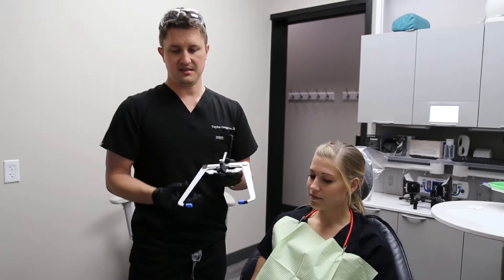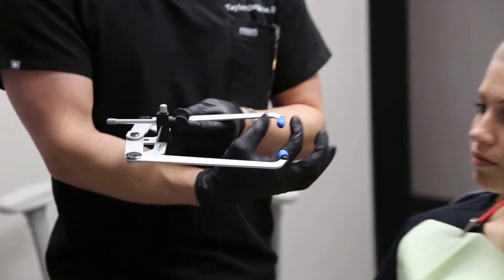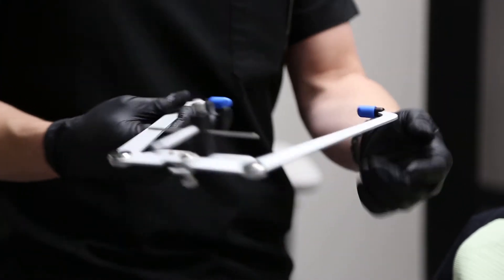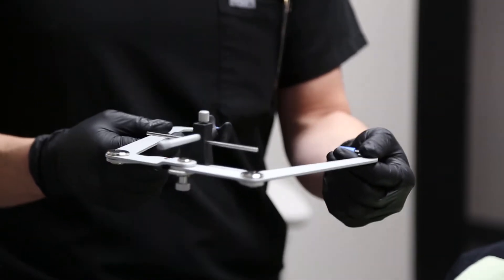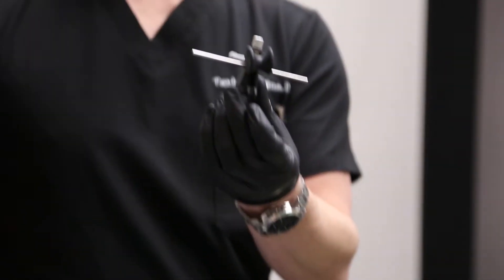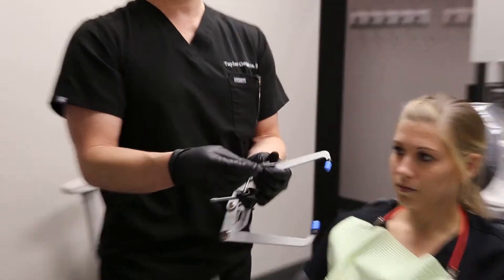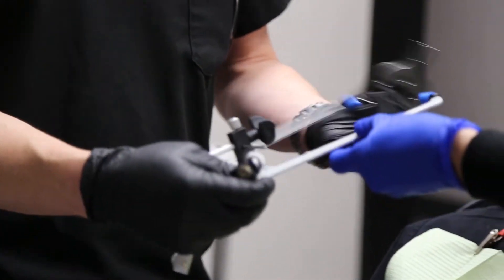This is the transfer bow that SAM makes. We've inserted blue ear pieces into the face bow to comfortably place it in the patient's ears. Using these makes it more accurate to relate the porion or the hinge axis from the patient to the articulator. This is the nasion relator — it will go on the bridge of her nose and inserts onto the face bow transfer. We'll also be using a transfer fork and transfer assembly to relate the bite registration to the transfer bow.